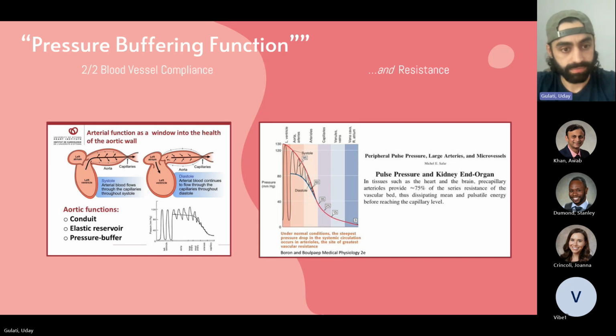Have you ever compared the two? You'll always notice that your pulsatility, meaning your high systolic and your low diastolic, gives a much wider pulse pressure via the femoral line than via the wrist, because there's a lot more resistance in the catheter in your wrist than there is in the femoral. And that femoral is likely a much more true pressure of perfusion in the arteries than it is in the wrist. It's got that elasticity to it with a high amount of resistance, so you are able to see that high amount of pressure.